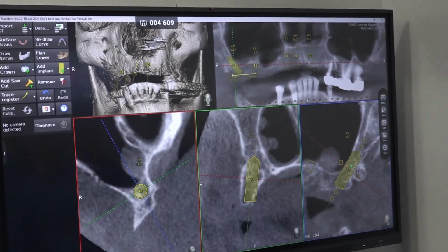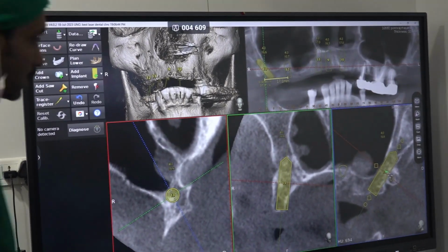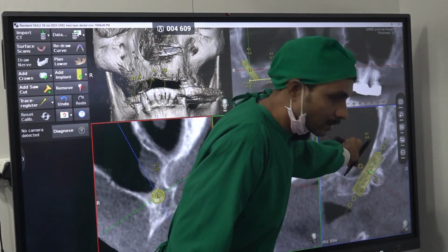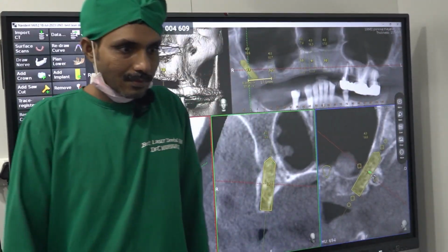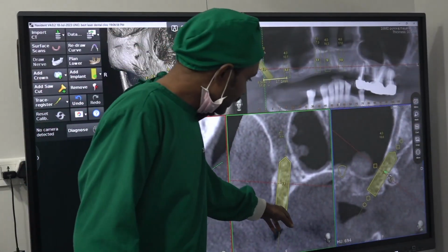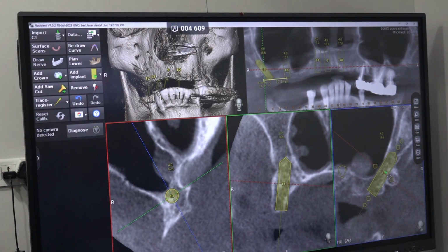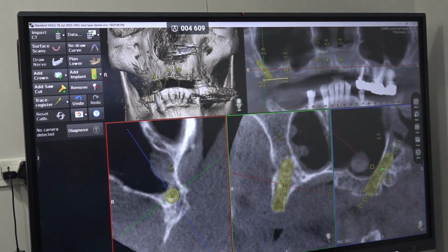Pterygoid implant we will discuss in depth tomorrow morning. If you see, the sinus has come down till here. If the sinus is still here, we can place a good pterygoid. Yes, that is the challenge. Exactly that spot. See, it is very buccolingual, it is very thin also. So, pterygoid implant is a separate discussion that we will do tomorrow.